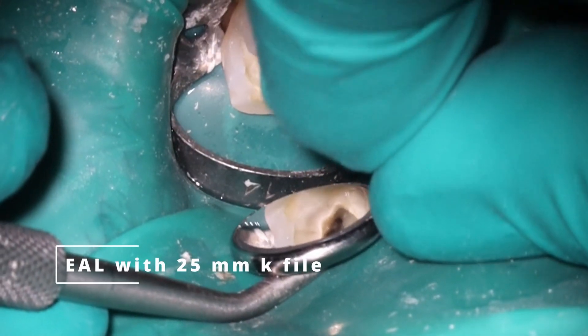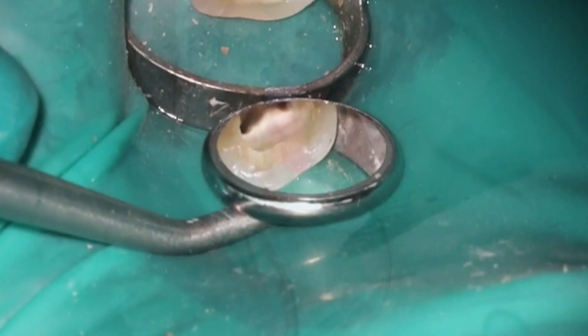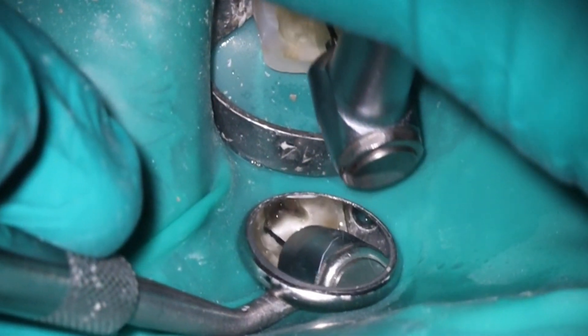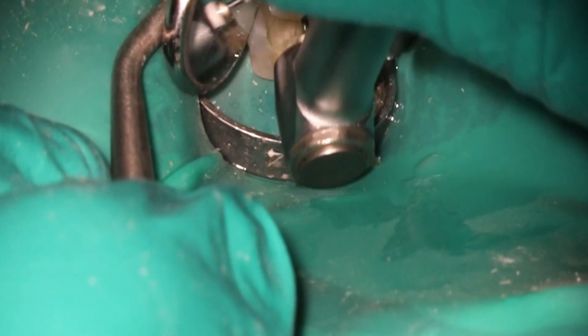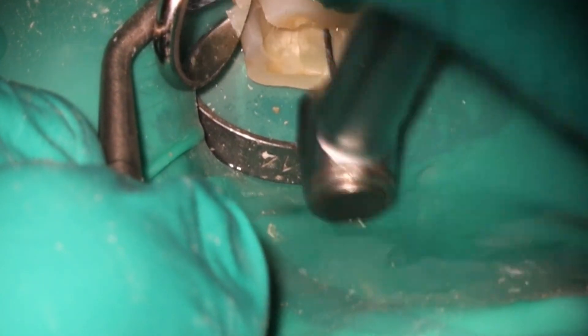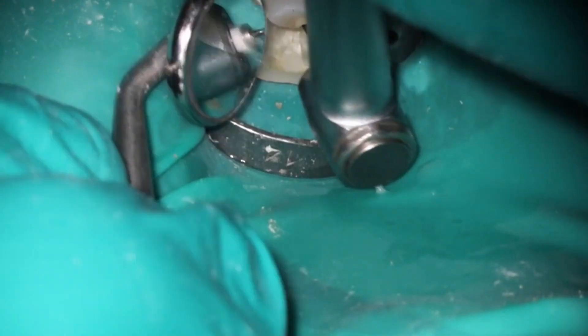And here we are getting our working length. I'm going to go ahead and skip the detail since everybody knows how we get working lengths. Once we get our length here, one thing I like to do is get my working length pretty dry, then put a little bit of liquid back inside before starting to run those rotary files. The tooth isn't calcified where you can't find anything — it is, however, a long tooth. Working length here is about 21.5 to 22 millimeters, depending on which canal you're in.